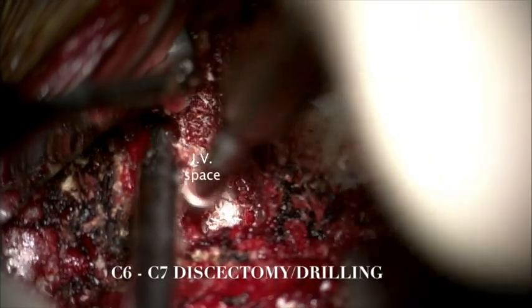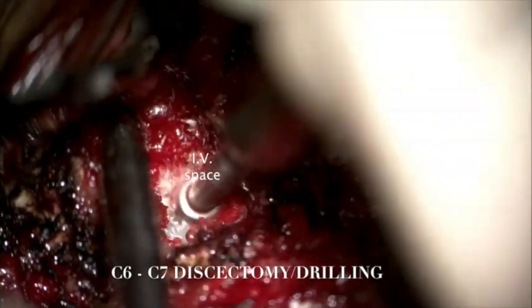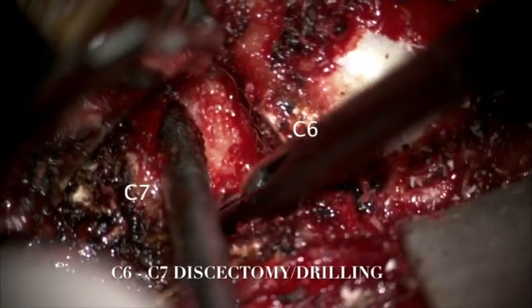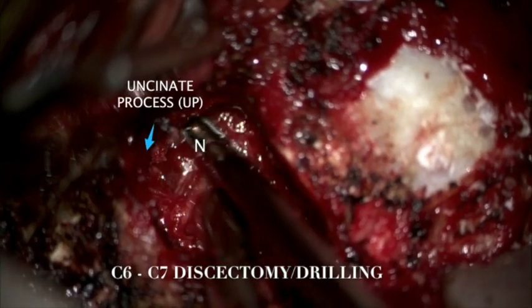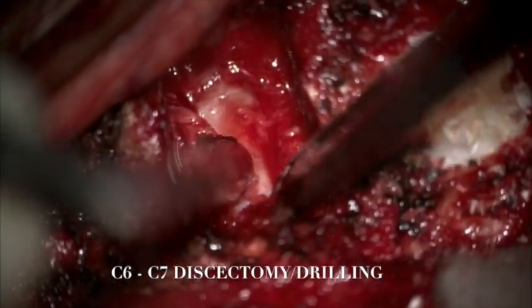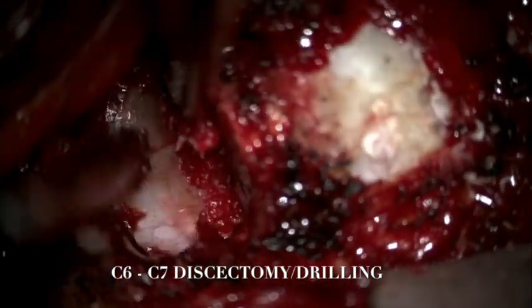We started the anterior cervical discectomy at the level of C6-7. We used the Midas-Rex drill with the M8 tip and shaved off cartilaginous endplates from the upper and lower surface of the vertebral bodies. Once bone bleeding at the junction of the cartilaginous endplates and the vertebral body was encountered, we stopped drilling. We then used 1-millimeter and 2-millimeter Kerrison rongeurs to take down the posterior longitudinal ligament and any adjacent disc osteophytes on both sides.